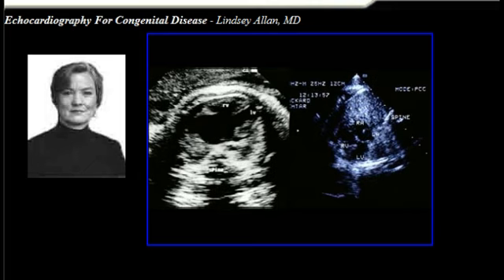I come from a different school from Dr. Van Praag, whose members are just as persuasive as he is. So I think this is right atrial isomerism.